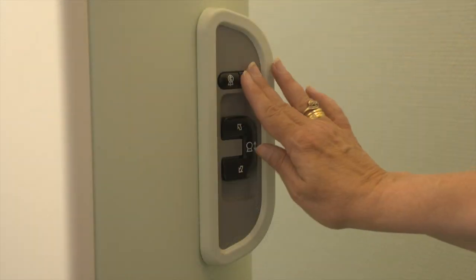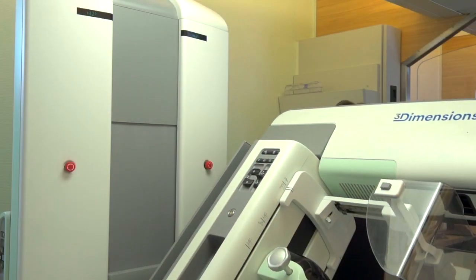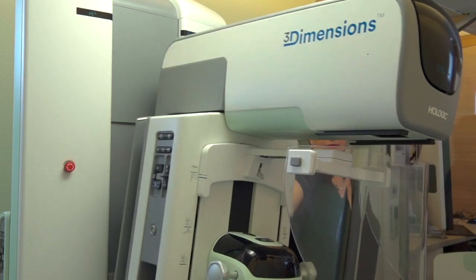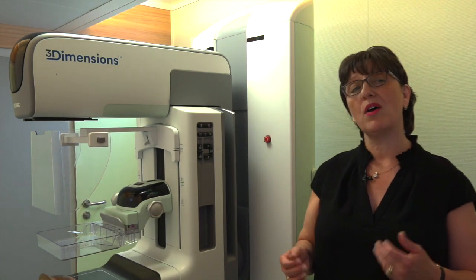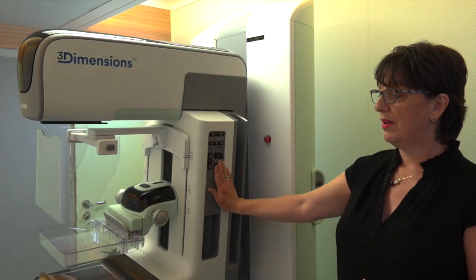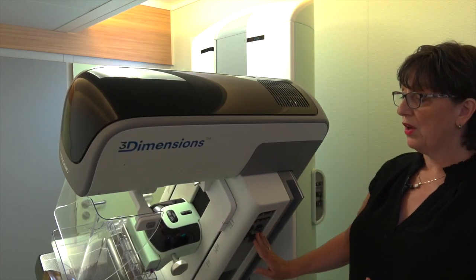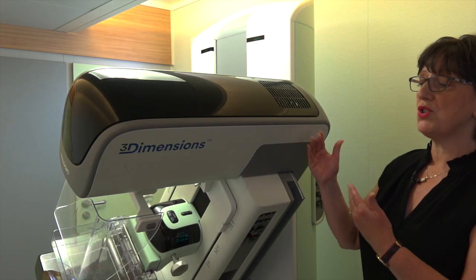We also have automatic movement just by pressing these two buttons here which brings the tube back into the center. One of the other really nice new features that we have is actually smart MLO positioning. So if I position the tube in the MLO, what I can do by pressing this button here is move the tube away.